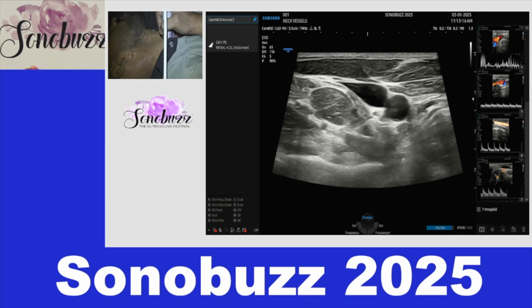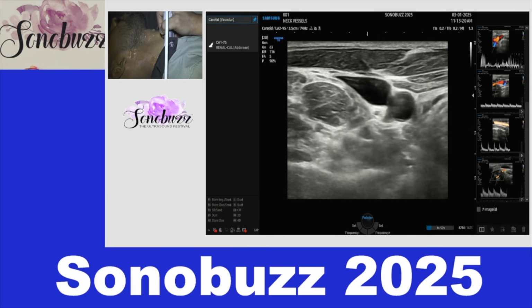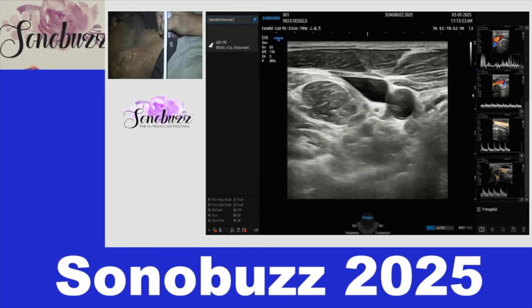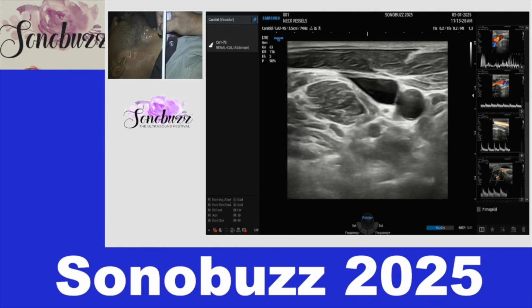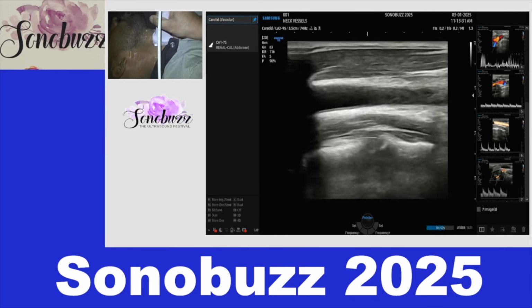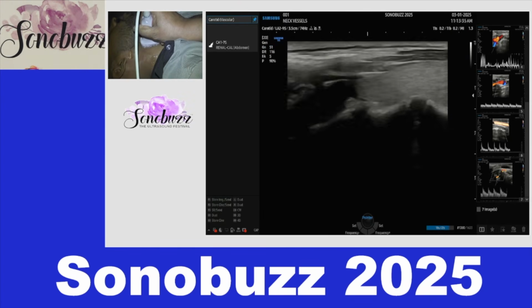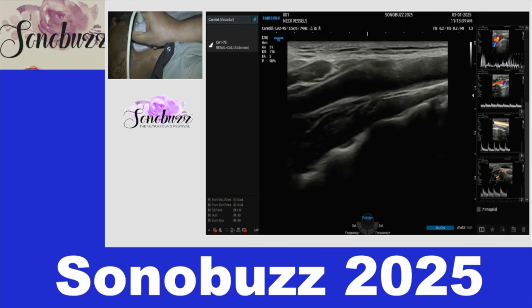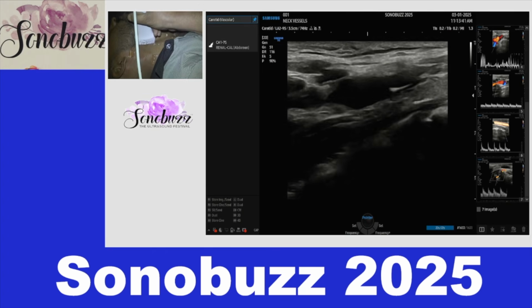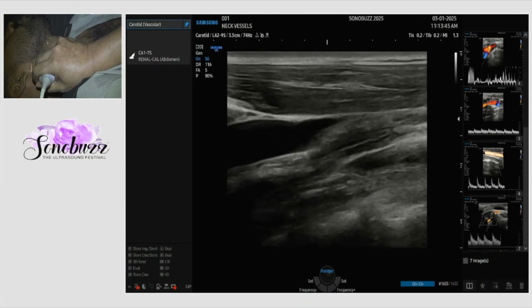Now that we have to take a spectrum, and we have at least seen that the bifurcation shows correct flow, your job is more or less done on this side of the carotid. What remains is the vertebral, which we'll see subsequently. Now we'll look at it in a longitudinal view, and again I'll continue running through till I reach the bifurcation. Here again there may be a tuning fork which occurs in some patients and doesn't in others, depending on the angle of location.